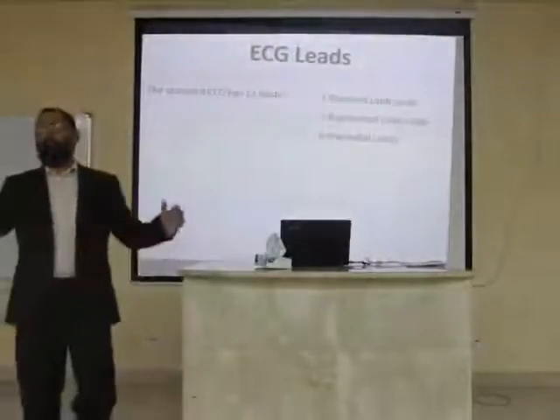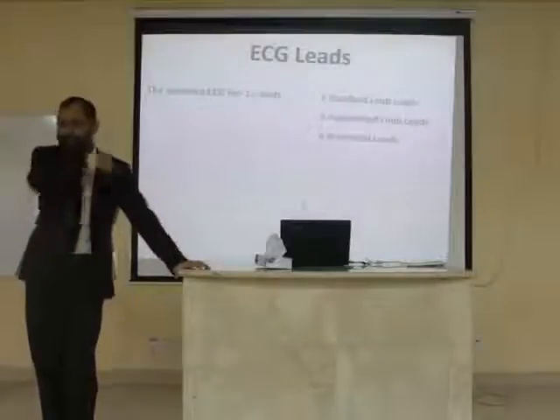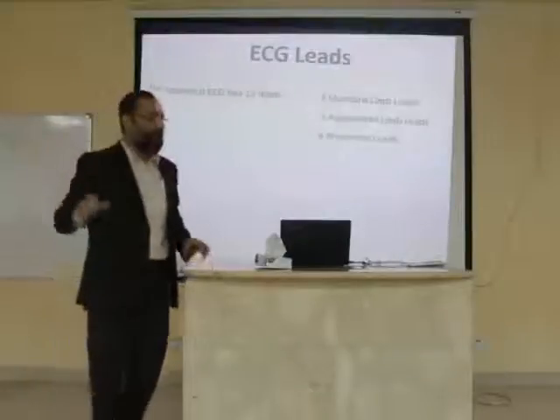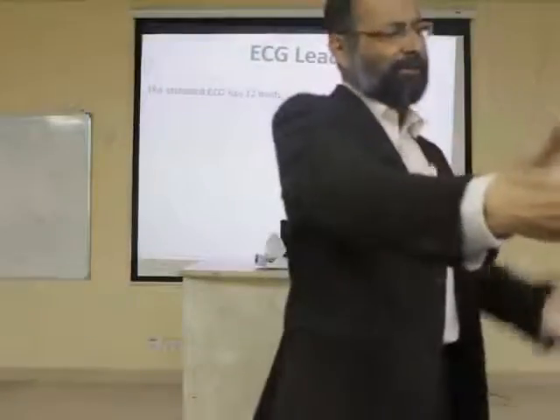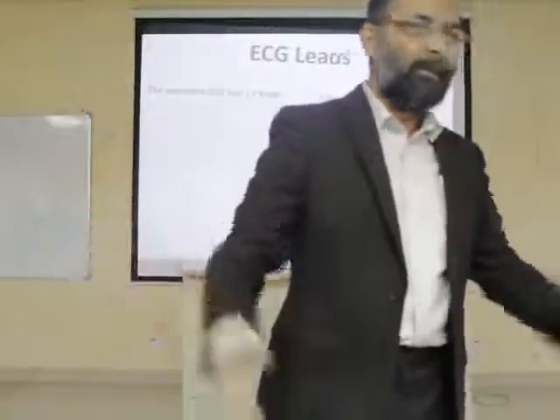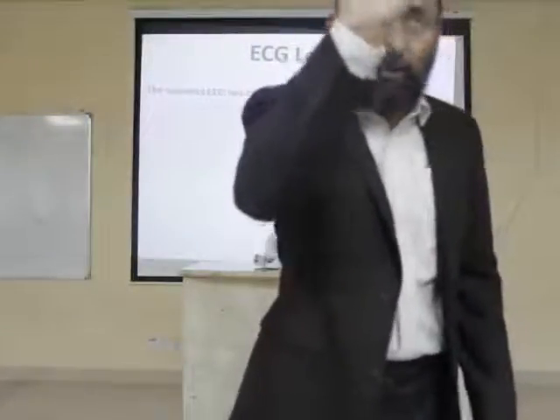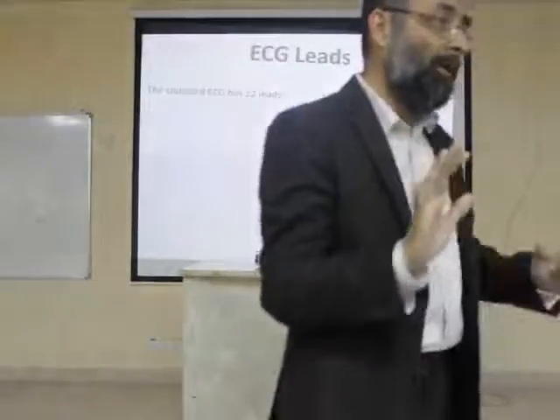Okay. Now you know, I say 3 leads are perfect leads out of these, and they are recording beautifully, very strong waves, very good voltages coming. No need to do anything for that. You see the result? So very good waves are coming. What are these 3 leads? Bipolar leads, okay? Because they are perfect system of leads. Remaining 9 leads are unipolar leads. They are weaker. Weaker means when you see the original recordings, the waves are coming, but small size of waves will come, okay?